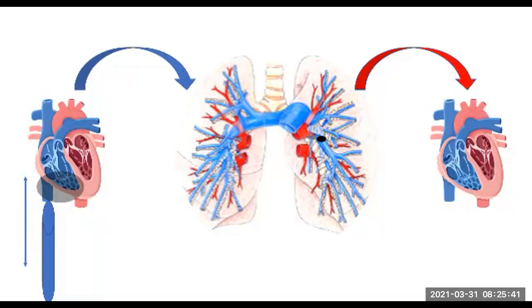together, all right? So what happens is initially the heart starts dilating, because this is a whole lot of backup, this whole lot of pressure that's building up. It starts to dilate, so eventually it will reach a point where it can no longer dilate. So what do you think we'll see if we were to look at the heart on ultrasound? We'd see an enlarged right ventricle that's non-contractile. Agreed. So that's one of the things we need to look out for.